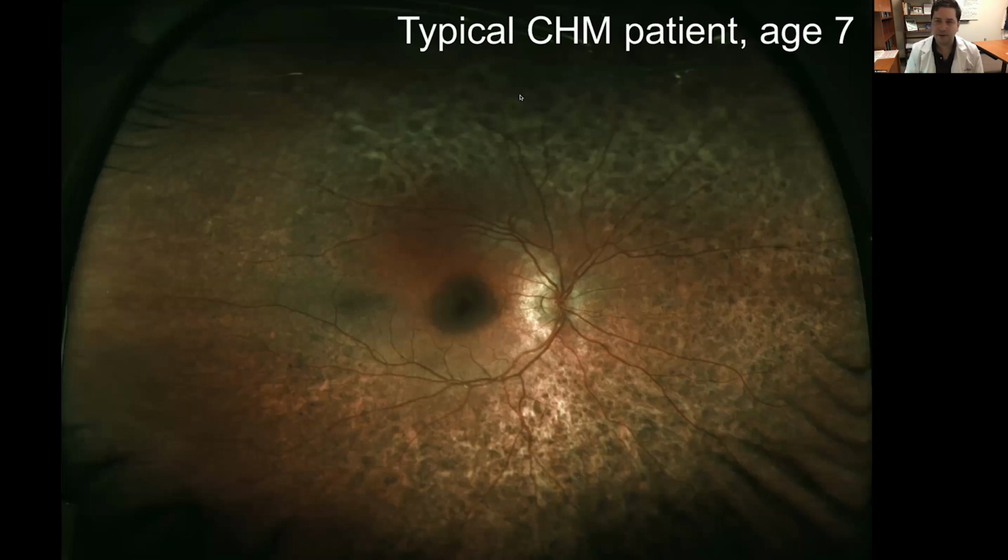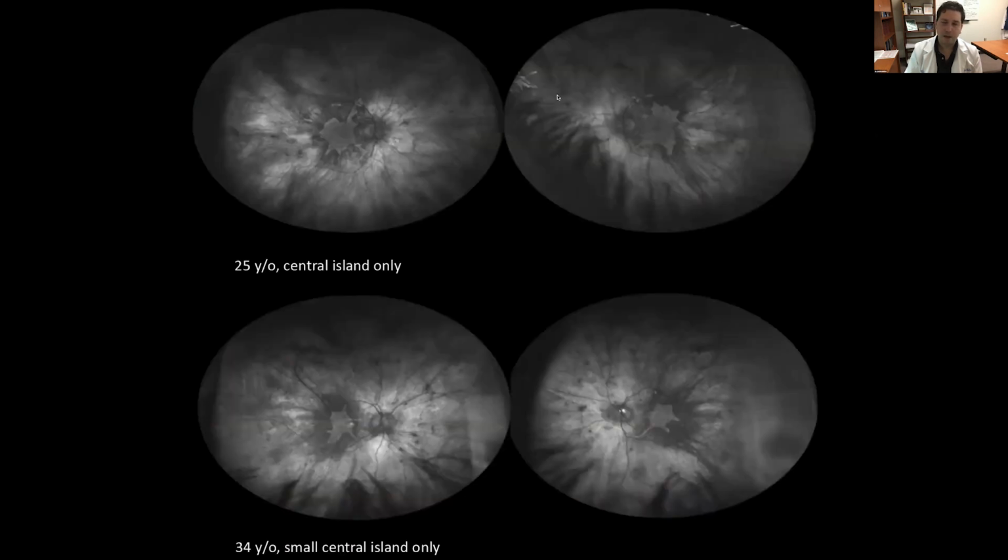RP is not the only kind of inherited retinal disease that we see in the clinic. Here we see an example of a patient with choroideremia, a young boy, age 7, who has good foveal and parafoveal pigmentation, but a mottled hyperpigmented change in the mid and far periphery, showing clumps of hyperpigmented lesions at the level of the RPE. This patient is probably complaining of similar things to the young child with RP, difficulty with dark adaptation, difficulty with nighttime vision, but probably having quite excellently well preserved visual fields at this young age of 7. Unfortunately, as is true in RP, it is also true in choroideremia.